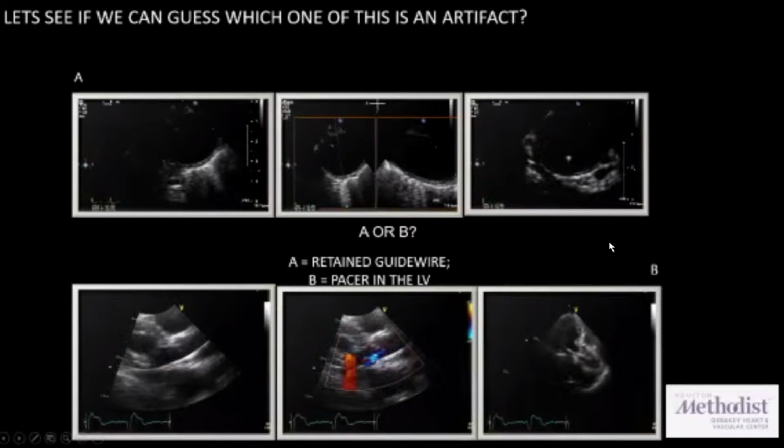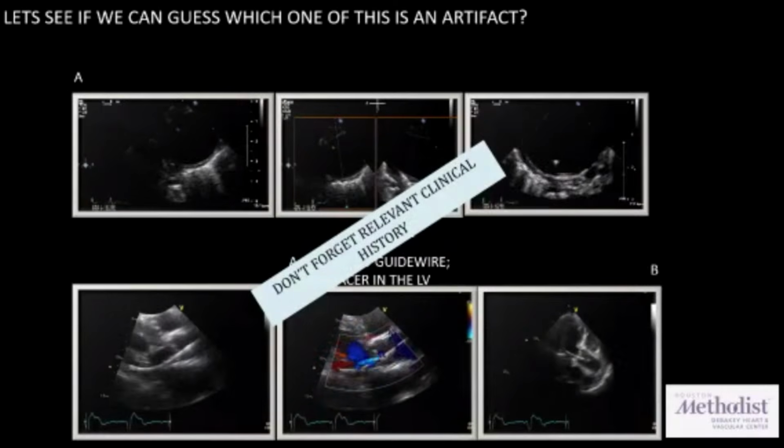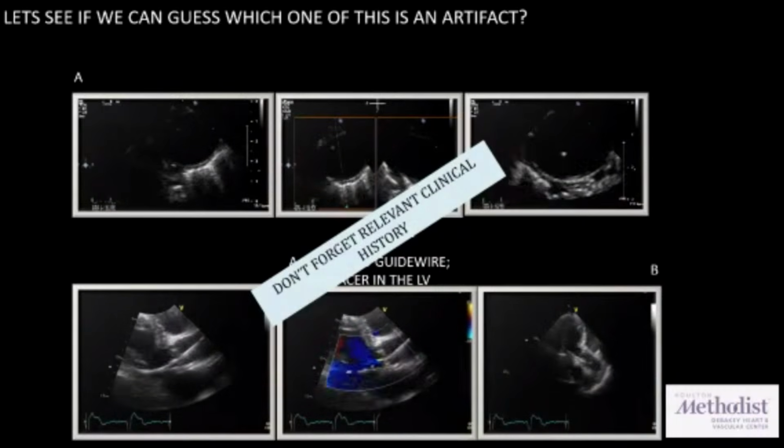This again, I just wanted to show you to reiterate the relevance of clinical history. Don't forget, not everything you see is an artifact as well. You want to put it in the right clinical context.